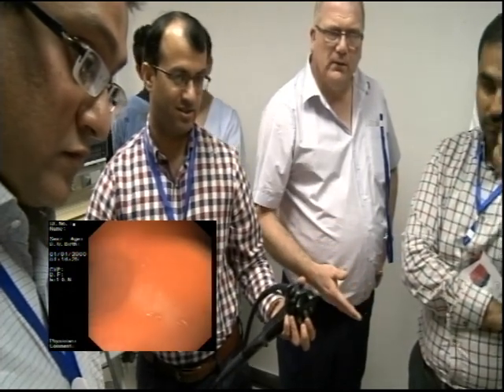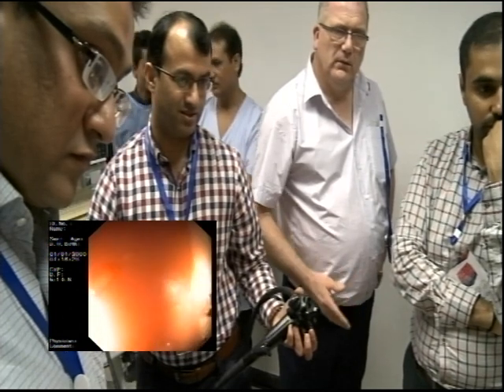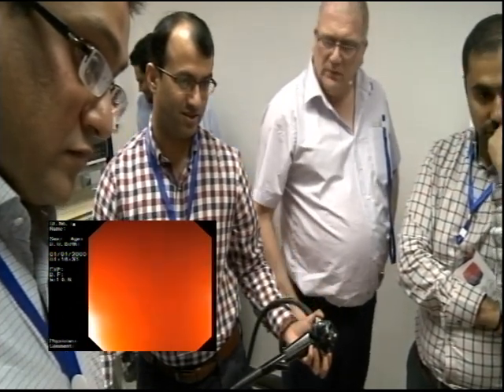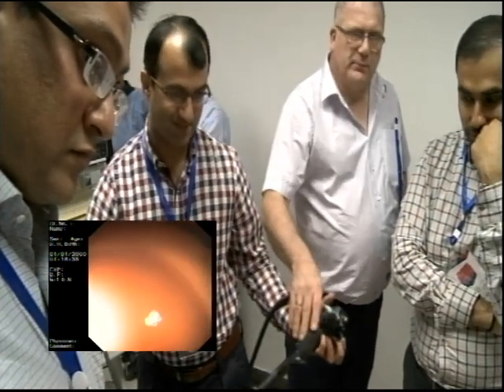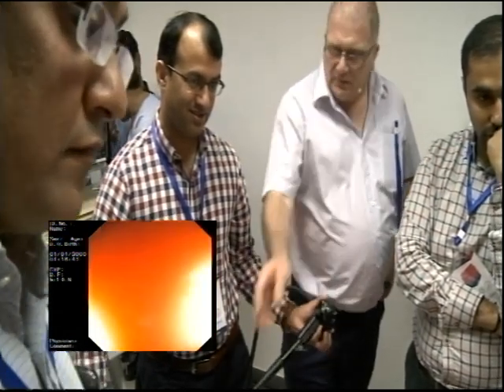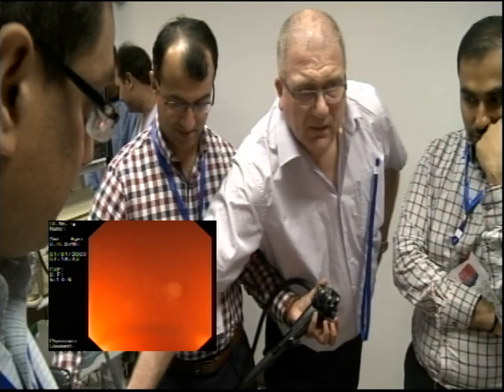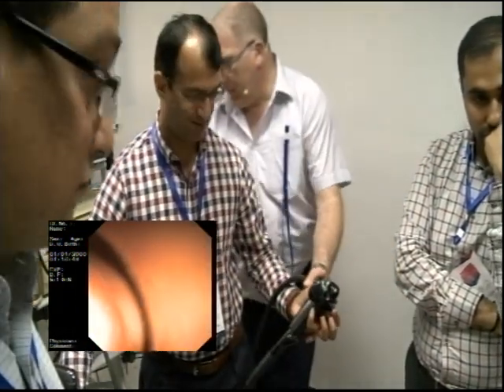Anti-clockwise torque. Anti-clockwise. More. More. More. More. More. More. That's because you're not wanting to use this. You're trying to force this down.